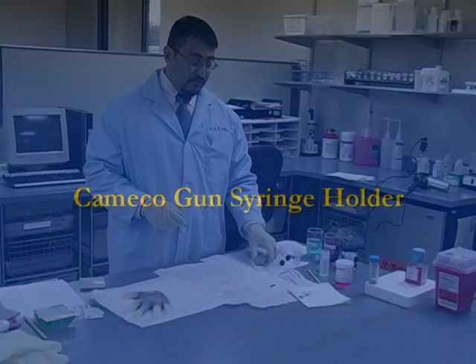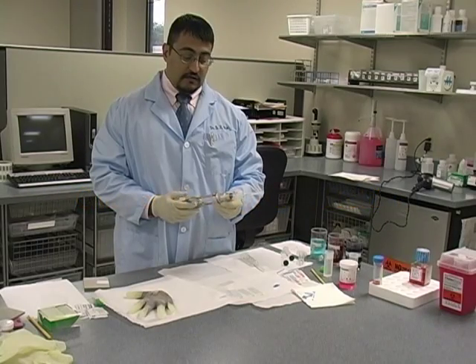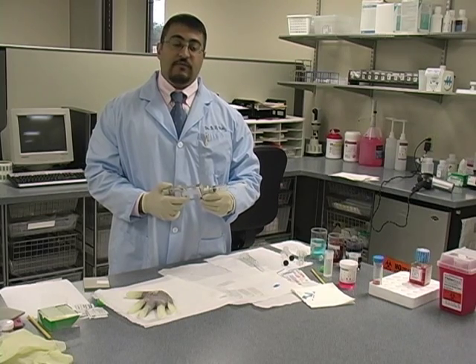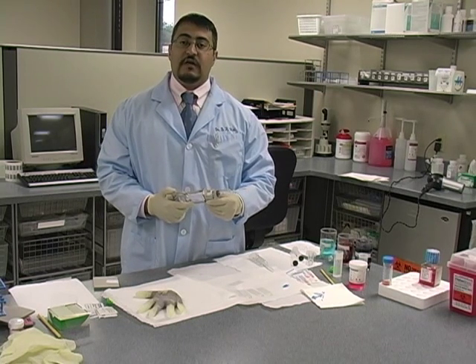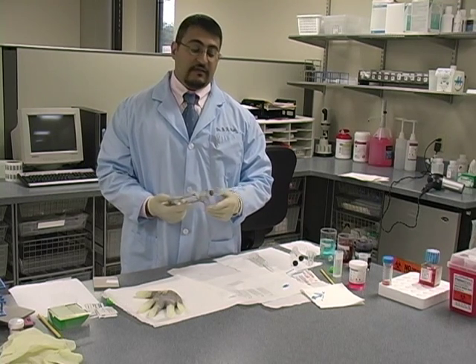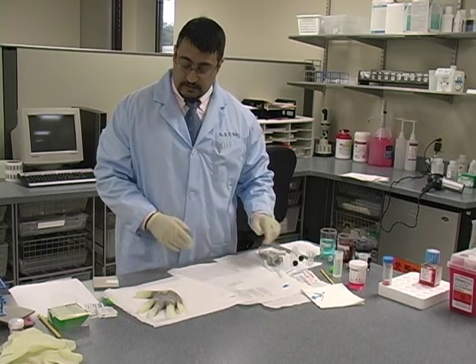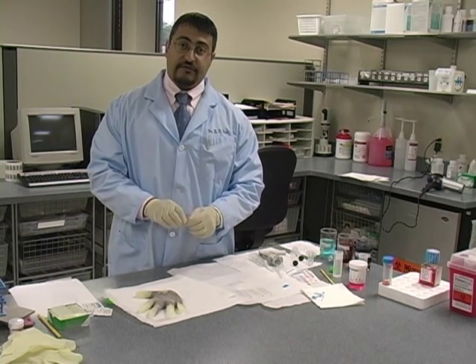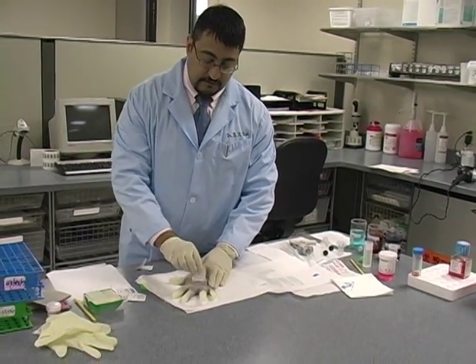Now I'll demonstrate the same FNA but this time using the Cameco gun. The advantage is you can get good suction and aspiration with this, but again you don't need that to get a good FNA sample. Sometimes I use this on lymph nodes when I'm trying to get a lot of lymphocytes and want a bit more force. It works well in thyroids too. The technique is very similar — we have our patient and I start by taking the skin and giving it a good cleansing.